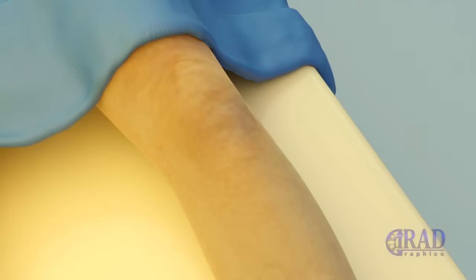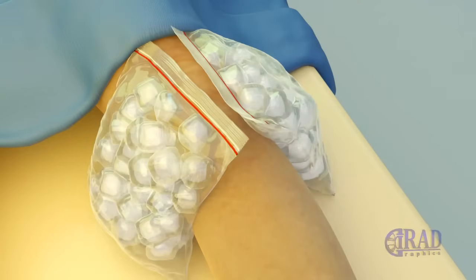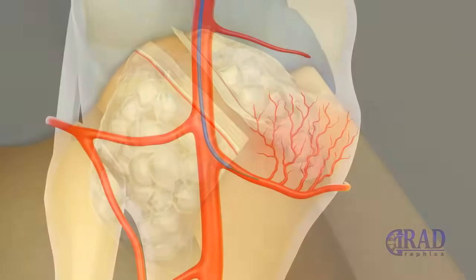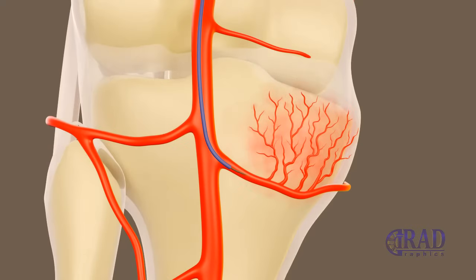At this stage, ice packs are applied to the target knee to minimize the risk of non-target embolization affecting the skin. Once the target vessel is catheterized, the microwire is removed, and genicular artery embolization is performed using microparticles until pruning of the inflammatory and abnormal branch of the genicular artery is achieved.